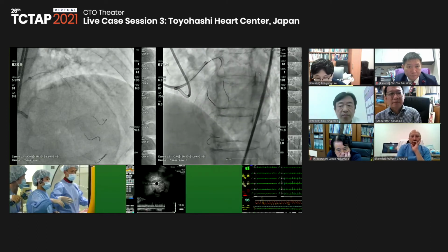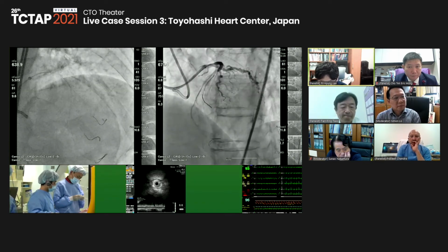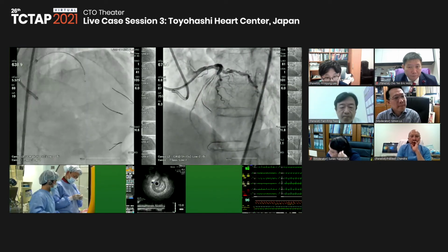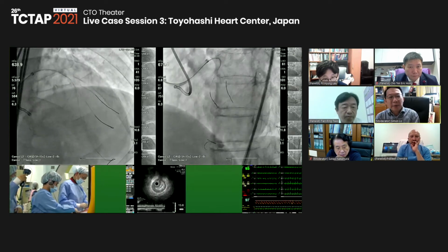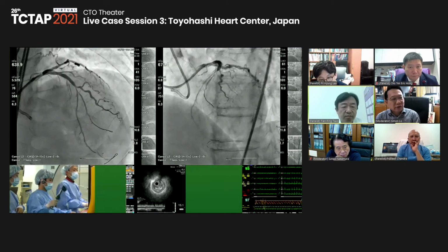The distal diameter, according to the IVUS, was about 2.0, 2.12, right? Yes, I think so. Well, would you use a 3 millimeter diameter stent? Because originally it looked like 3 almost.